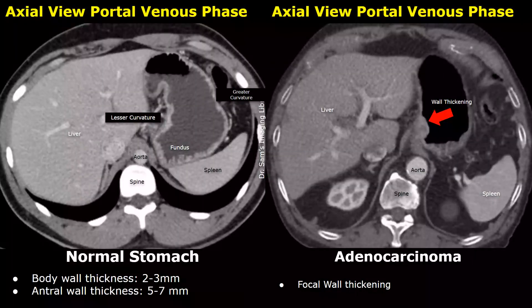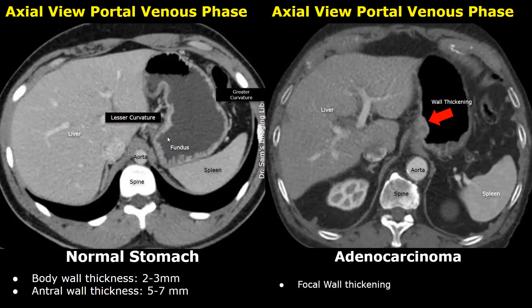The image on the left is from the portal venous phase showing a normal stomach. The stomach wall adjacent to the spleen is the greater curvature, and the stomach wall near the liver is the lesser curvature. This is the fundus, the upper part of the stomach. The stomach parts are more easily seen in the coronal plane.